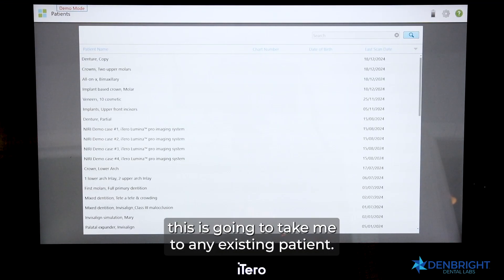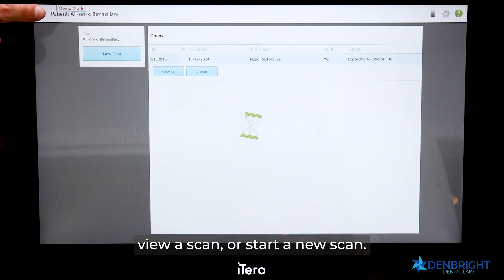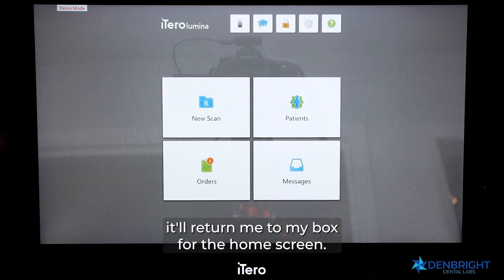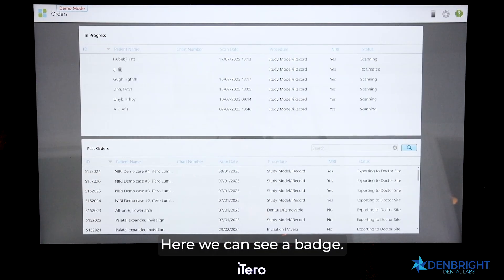Our next box will be the Patients box. Clicking this takes me to any existing patient. If I click into a patient, I can view a prescription, view a scan, or start a new scan. Clicking my back arrow will return me to the home screen.